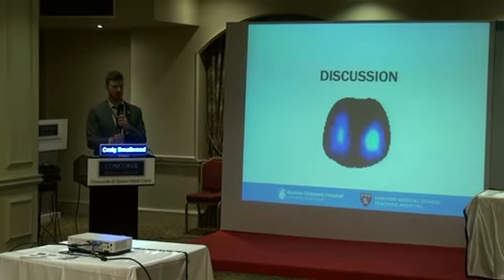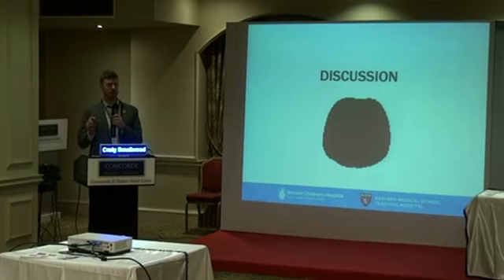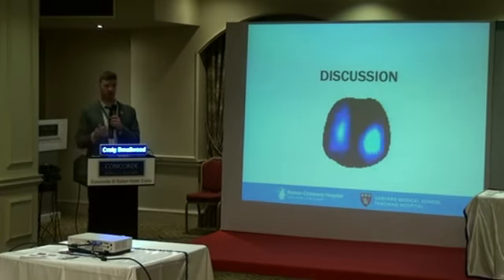We said, you know what, we trust it, we've used it observationally in our ICU enough, we're gonna go to the animal lab and design an experiment such that we're gonna trust data that this device is telling us and use it to intervene to guide care. And what we did was basically targeted PEEP and tidal recruitment maneuvers in these animals who we gave ARDS to. And so it's really, I think it's phenomenal data, and I'd be happy to share with you this afternoon, but that's basically exactly where we see the technology going, is a decision support tool, not just a pretty image to look at. Thank you.